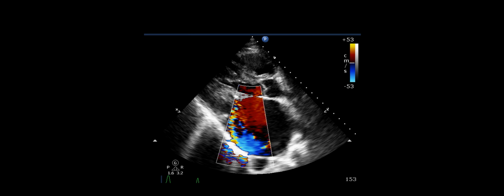When we're doing colour Doppler, flow that goes upwards towards the transducer will typically appear red, and if it's flowing down away from the transducer, it'll typically be blue. So flow upwards towards the transducer, red, blue if it was travelling away from the transducer, not unfortunately to depict arteries and veins. So blue away, red towards is the acronym for the BART principle.